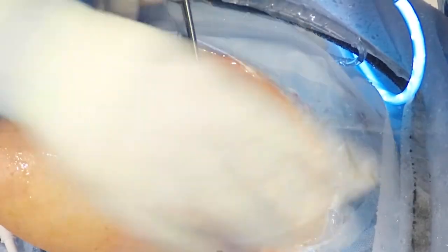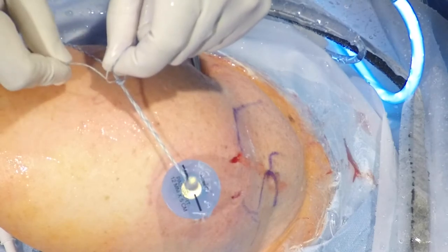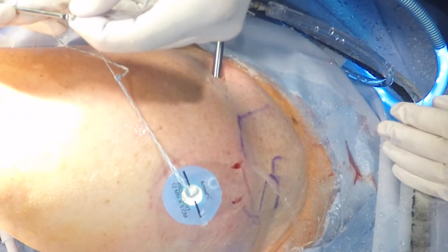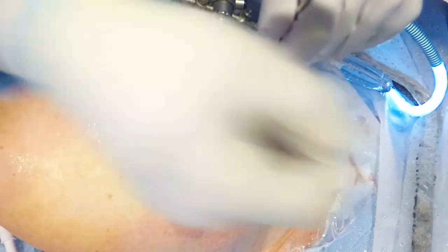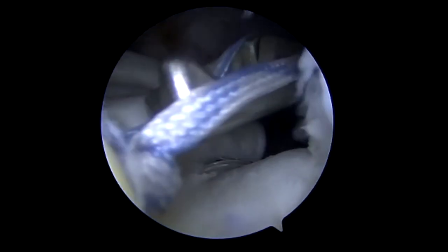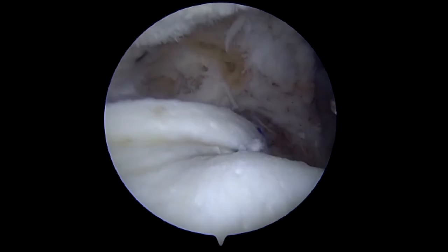We are using a Duncan loop here, a type of arthroscopic stitch, and passing it through the loop — this will be a sliding knot. We use a knot pusher and push that knot down, basically bringing the dermal allograft towards the infraspinatus posteriorly and helping to close that gap. We should get ingrowth to the margins of this graft, so this particular step is important. This will further strengthen the construct and provide essentially complete coverage of the interval between the glenoid and the greater tuberosity, preventing superior migration of the humeral head. You can see it's tight like a drum — that is what we want to achieve.